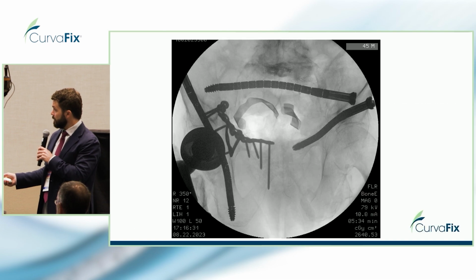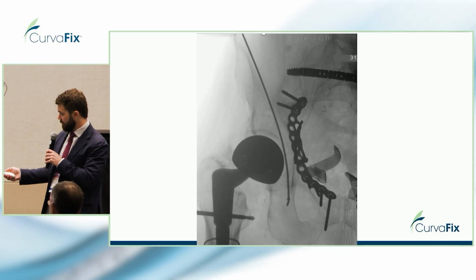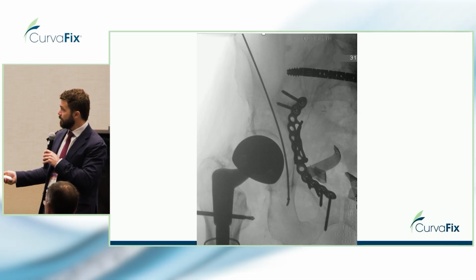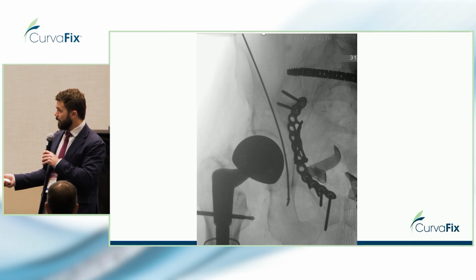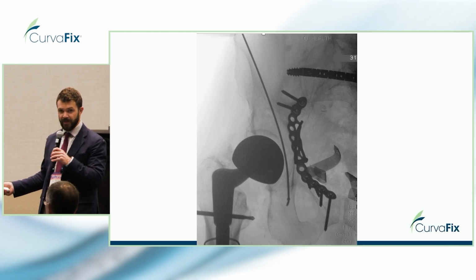Another important thing I wanted to mention was, as you're using the guide wire steering past the pelvic brim, oftentimes that's where the fracture is and it can exit there. You can use, percutaneously or within that same incision, sliding under the iliacus muscle, a malleable or a Cobb or some other instrument as a blocking instrument to prevent it from passing there. Serendipitously, this person had a quadrilateral surface plate already that acted a bit as a blocker there.